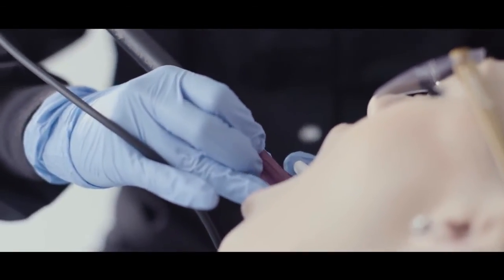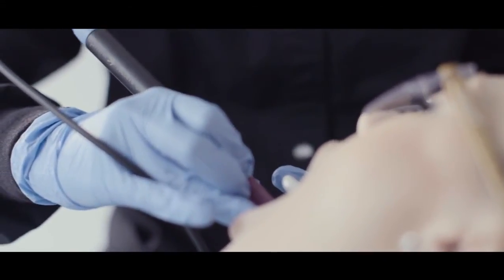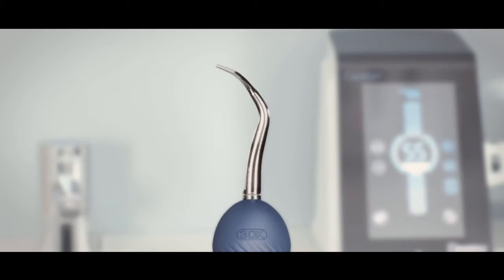Another key to optimizing performance is using a well-maintained ultrasonic insert. Did you know that the last four millimeters of the tip is referred to as the active area? This area is responsible for the removal of calculus and biofilm.